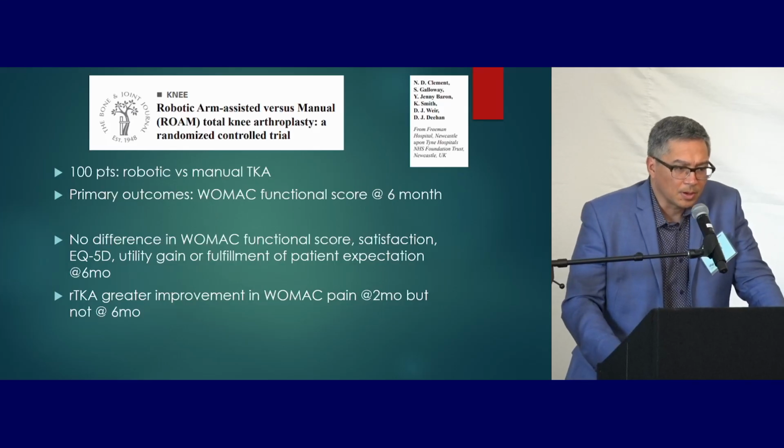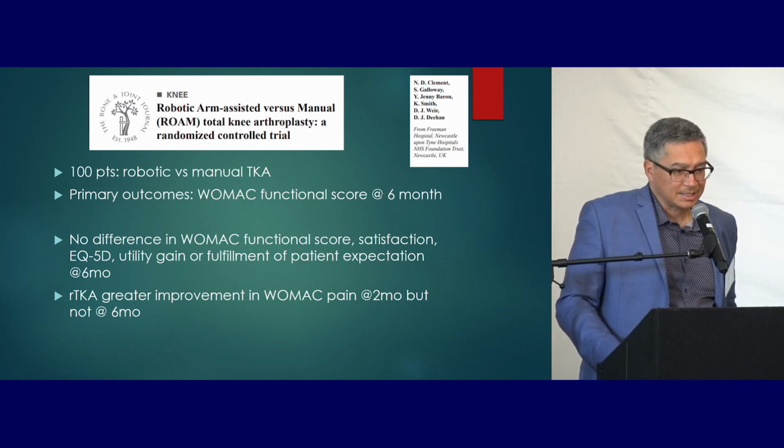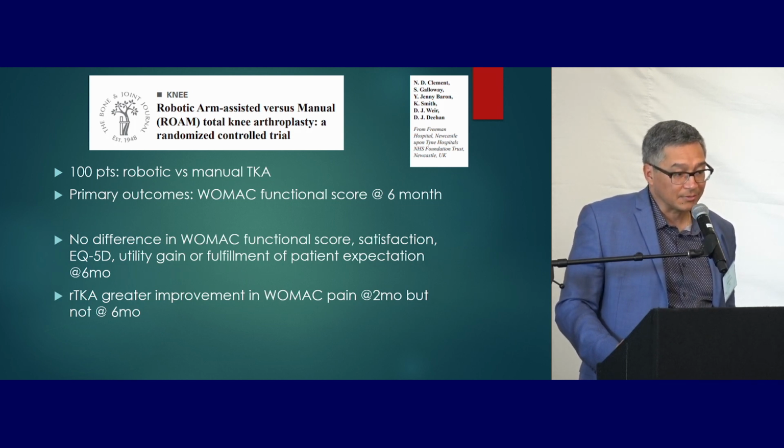So this paper was one randomized controlled trial on this topic in the past year, with the primary outcome being the WOMAC functional score at 6 months. And they didn't actually find that difference, but they did find a greater improvement in the WOMAC pain in the robotic group at 2 months, which sort of fell out at 6 months.